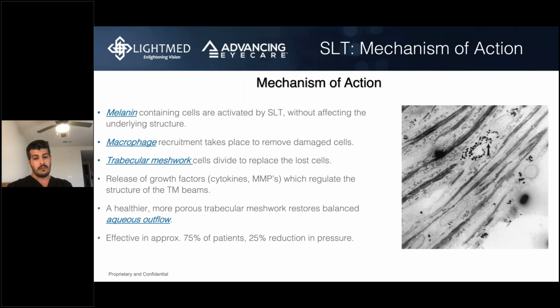So it's less effective because LTG, as you know, stands for low tension glaucoma, and you're going to get less of an IOP reduction the lower the pressure is. So again, let's say you have 2 patients with glaucoma. One is at a baseline pressure of 12. One is at a baseline pressure of 25. The patient with pressure of 25 is going to get a lot of IOP reduction with SLT. It doesn't mean that the patient with pressure of 12 is not going to get any response, but you can't expect high amounts of reduction.